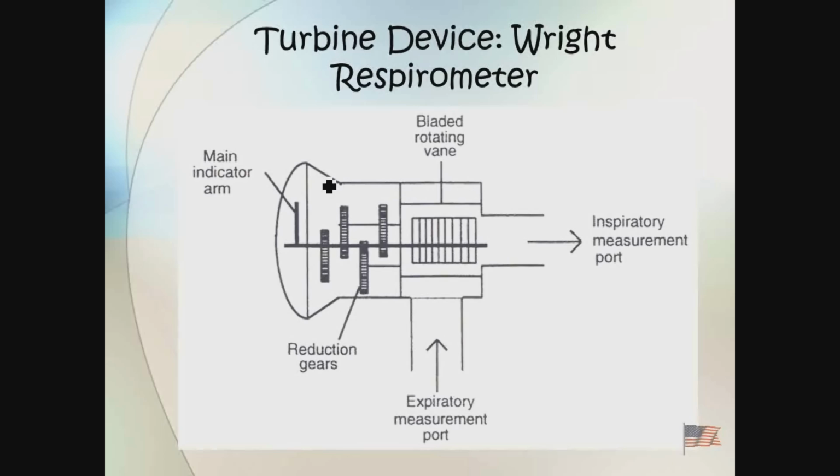But what we end up having here is basically a rotating vane that spins and causes these gears to move.